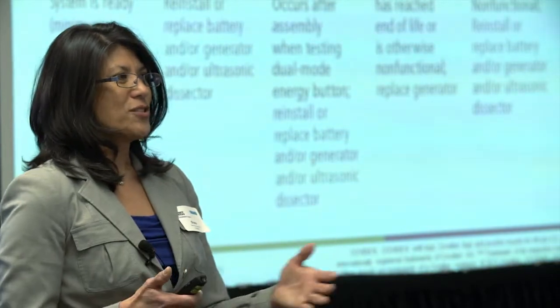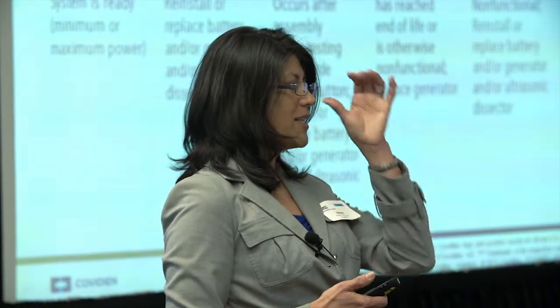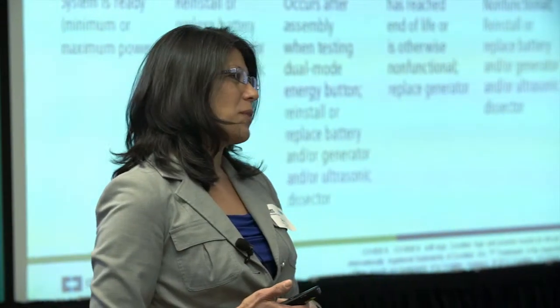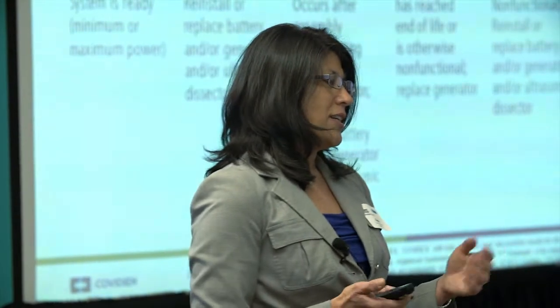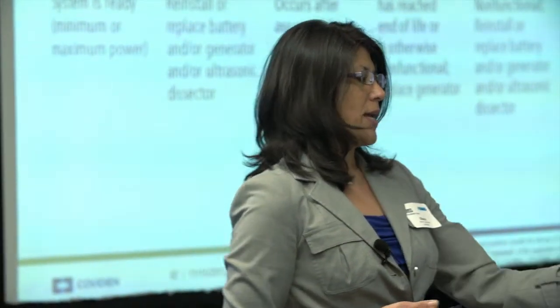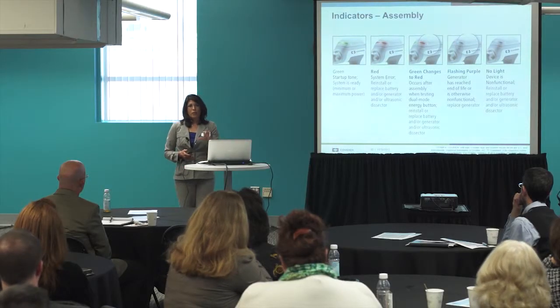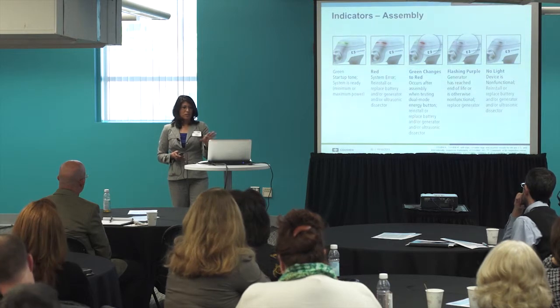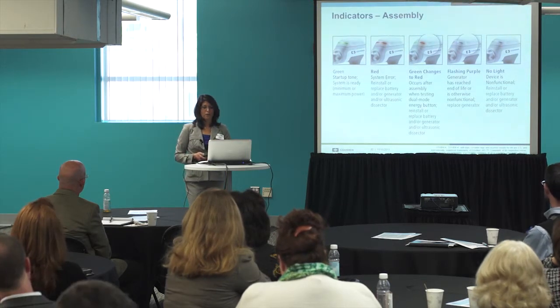And most of the time the answer was purple, so our white had a little bit of a purple hint to it. So what we ended up doing was basically change our IFU to indicate purple, because that's what people were recognizing. So this page is actually a page from our IFU. And what I'm trying to say is that we used our testing to drive the information that we put in our IFU.